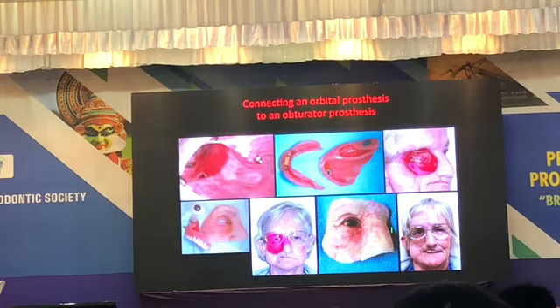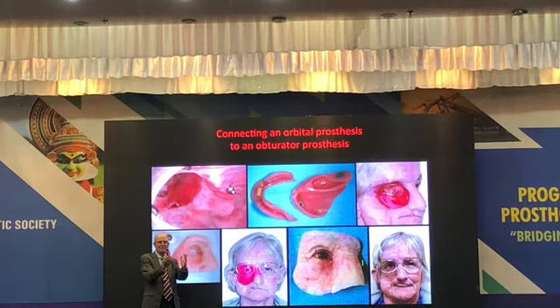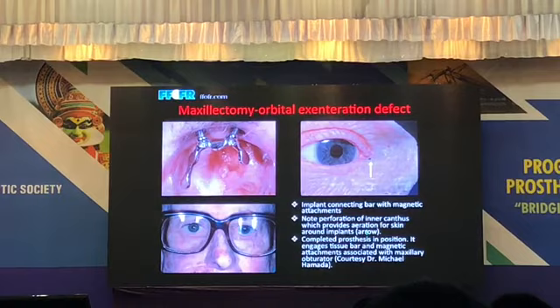Here's another one. This is a lady I did quite a few years ago. One implant is all it took to hold everything together. Because you're connecting the orbit, the facial, to the appliance, it all comes together. And it's like a clamp. It stays together with one implant. So it doesn't take a lot if you engineer these things properly. This is Dr. Hamada's patient that he did when he was a resident, and you can see the way everything is united together.